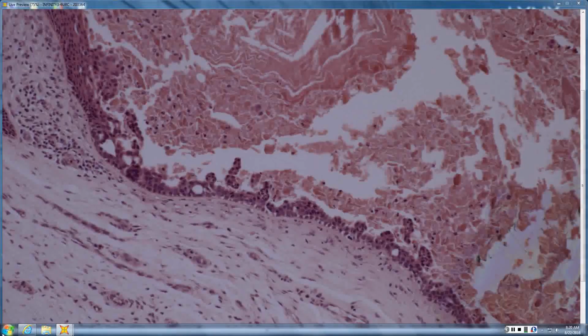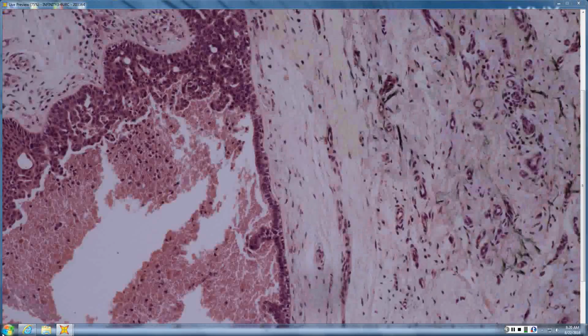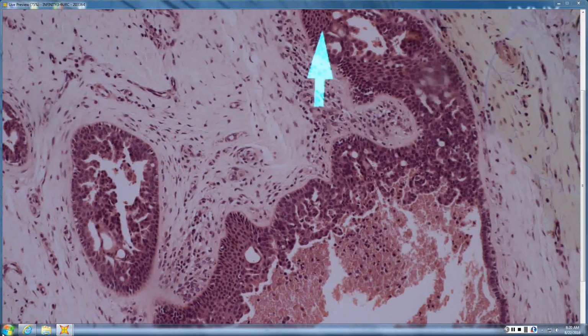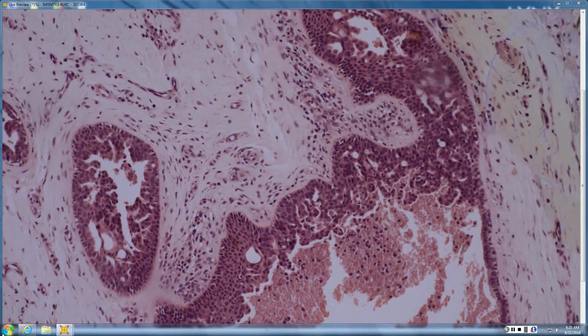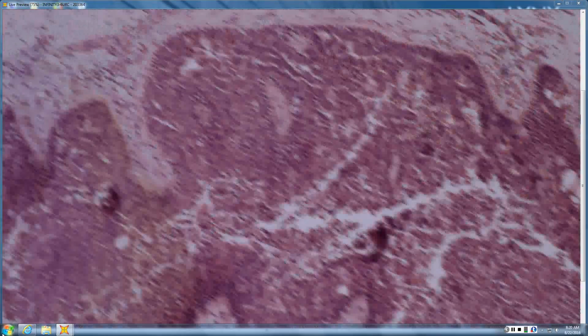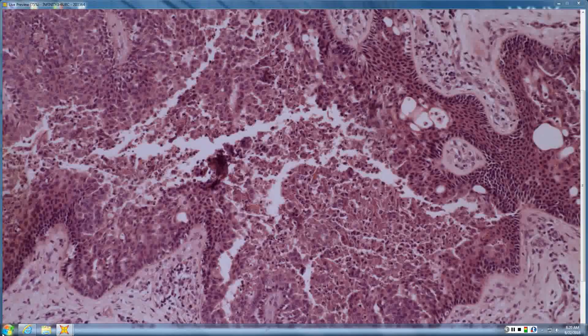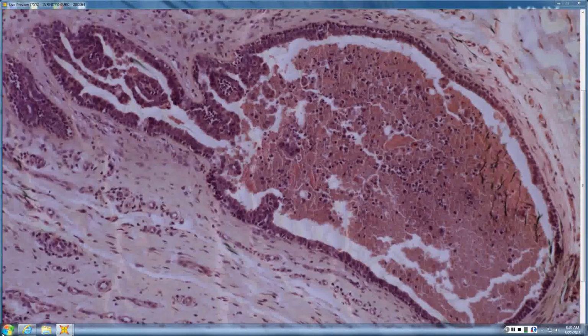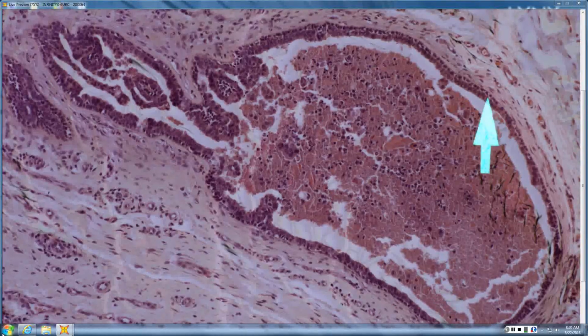I'm not picking out a good myoepithelial layer in some of these islands, but parts of it look very well differentiated and ducty, like a cystadenoma type of tumor. So the question is, is this just cystadenoma with some pyknosis of nuclei and programmed cell death, or is it worse? You might look at a MIB, you might do a P63 and show that focally you do have myoepithelial layer preserved.